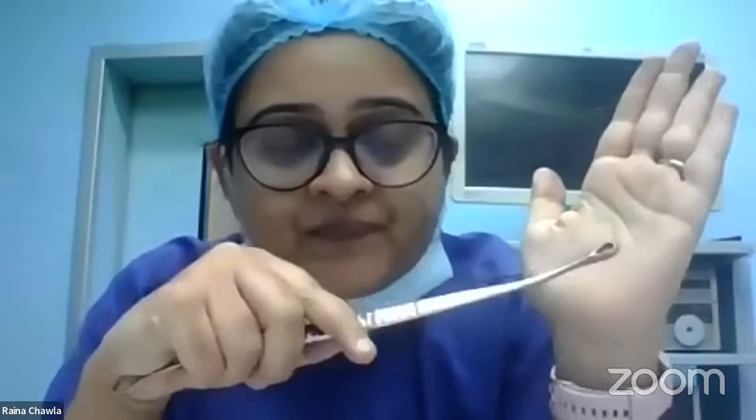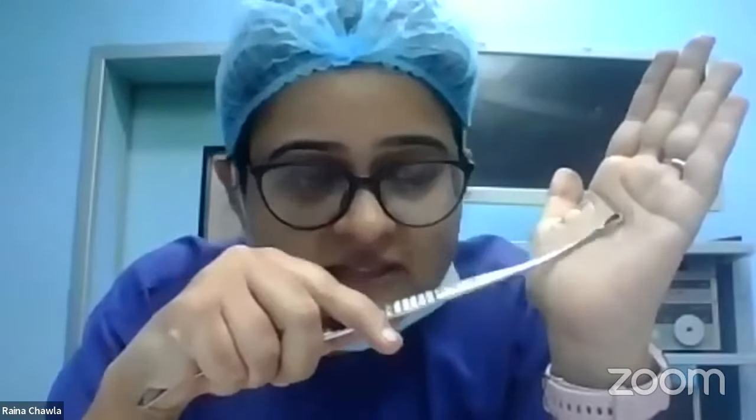Say you are doing an endometrial biopsy for abnormal uterine bleeding, or you have a patient who's come with persistent bleeding, say a 45-year-old lady with persistent bleeding not responding to medical management. You want to do a therapeutic or hemostatic curettage. So we do a curettage with this, we get tissue for biopsy and the bleeding also stops. So this is used for gynecological purposes. The blunt end is used for obstetric purposes.